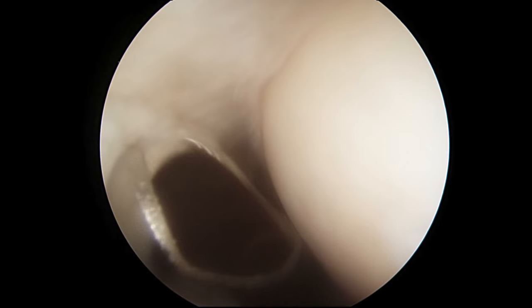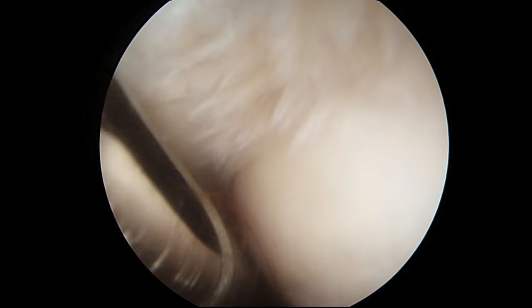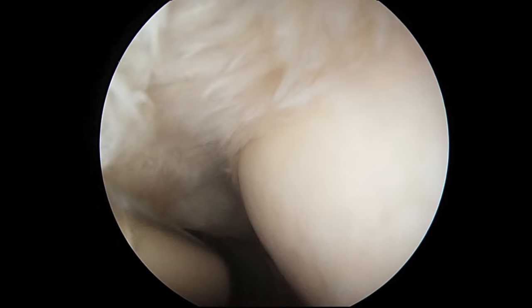A general rule of thumb amongst most shoulder surgeons is that if the rotator cuff is torn more than 50%, you need to repair it. If it is less than 50%, the remaining fibers usually function quite well and they do not need to be repaired. Often that decision has to be made at the time of surgery when we can really measure the amount of tearing. In this patient, it is so far less than 50%.